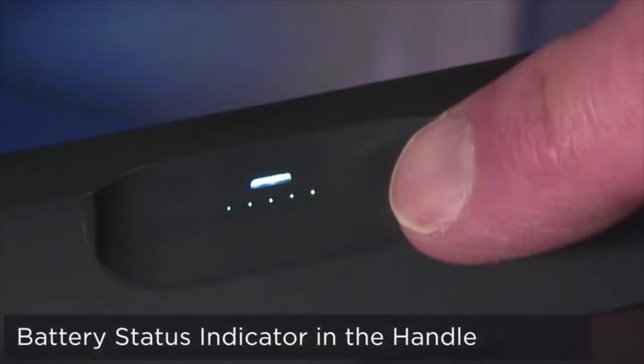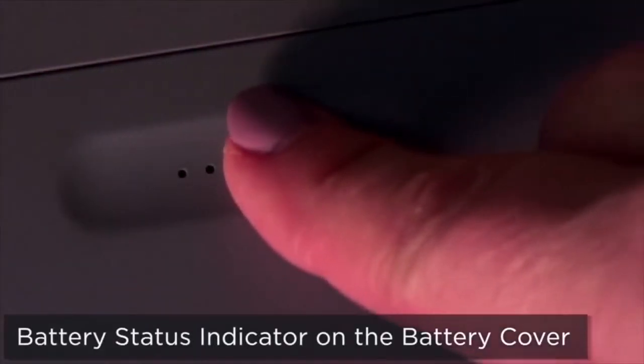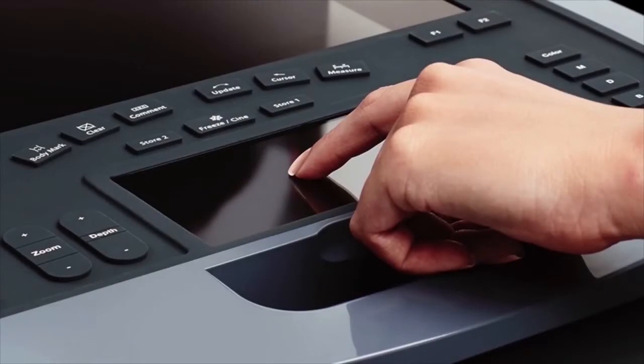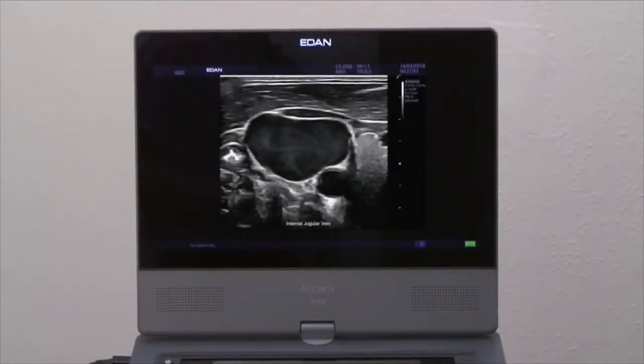There are two touchscreen sensor battery level indicators — one conveniently located in the handle and the other on the battery cover. Using the highest quality materials provides not only the exceptional fit and finish you see, but adds functionality and durability to the system.